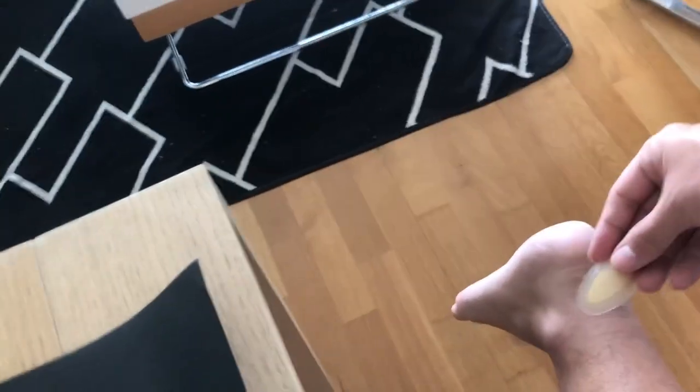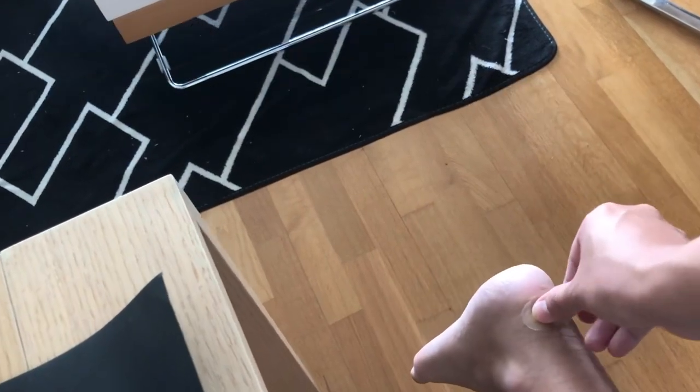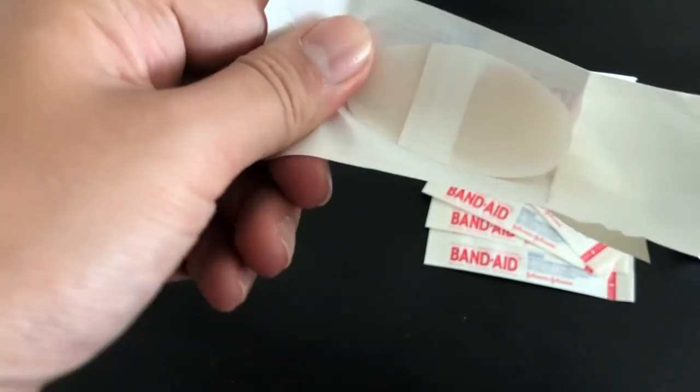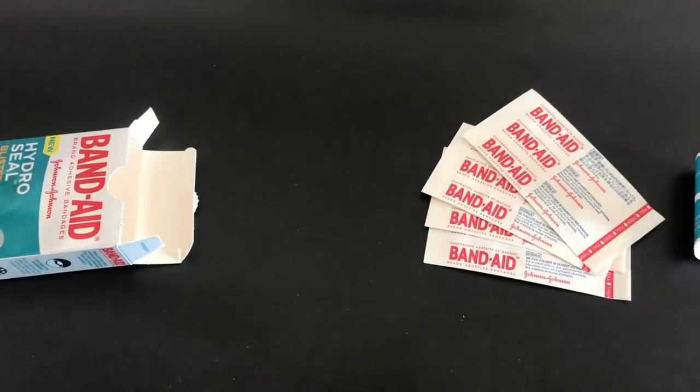In order to ensure a tight seal, gently press down on the bandage and make sure that the edges are firmly attached to the skin. Before changing it, wear the bandage for up to 3 days. Reapply the bandage as required if it starts to come loose.